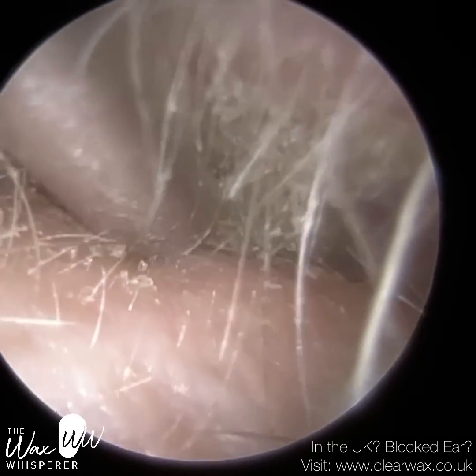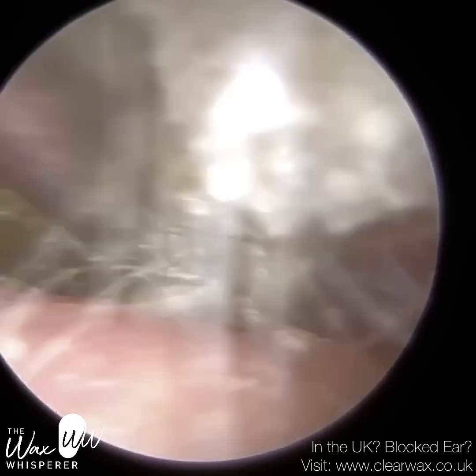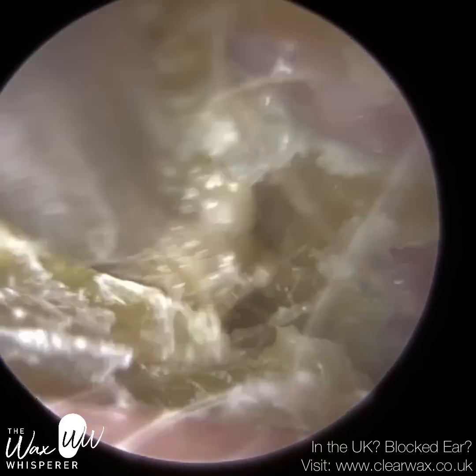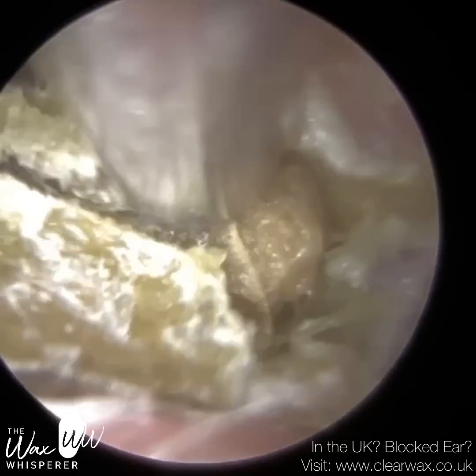They also have some wax and dead skin. There is a bit of inflammation at the entrance of the ear canal, which narrows the entrance route. But once we're into the ear, the ear canal does widen somewhat.